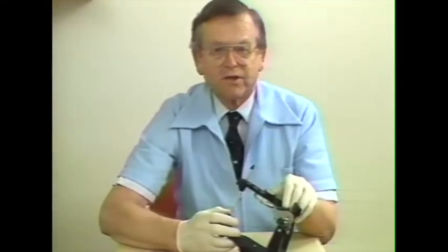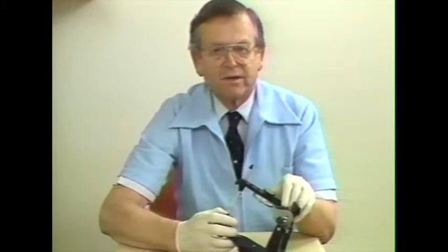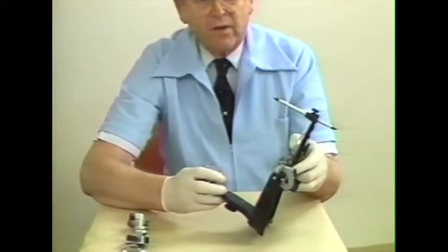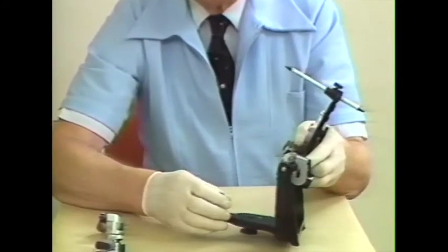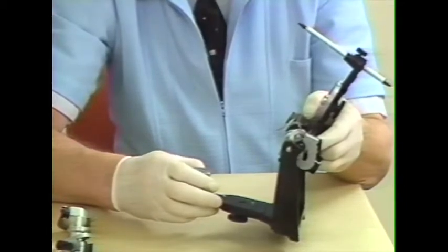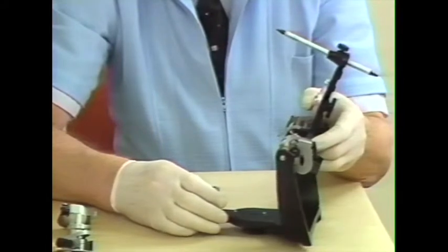The modular articulator has a number of features which allow the clinician to select the type of articulator he desires. First, it is an Arcon articulator, which means that the condylar elements are on the mandibular arch and the fossae elements are on the maxillary. This more closely duplicates the actual relationship on the patient.